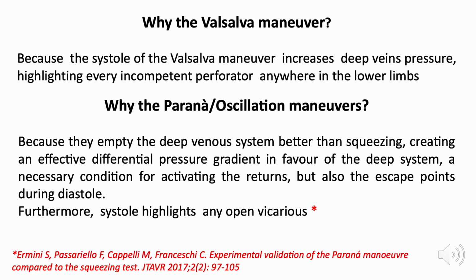The Valsalva maneuver increases runoff resistances and so the deep venous pressure, highlighting the existence of a closed shunt and of an incompetence of a perforator anywhere in the lower limbs. Systolic and diastolic occurrences must be described as well as the flow at rest.